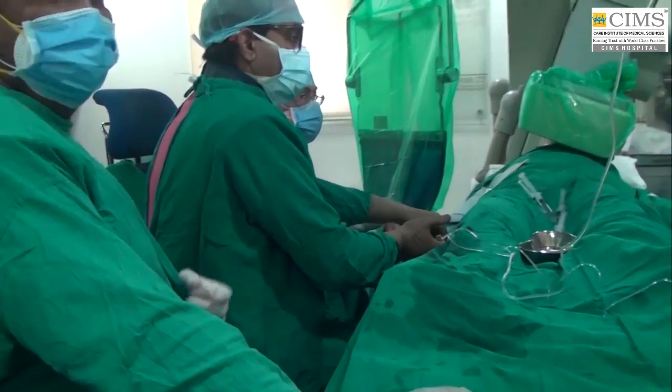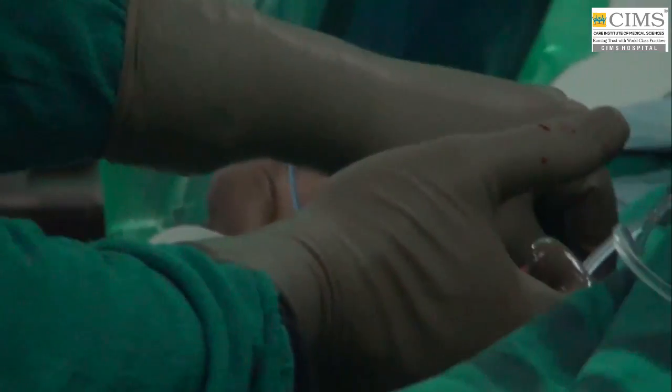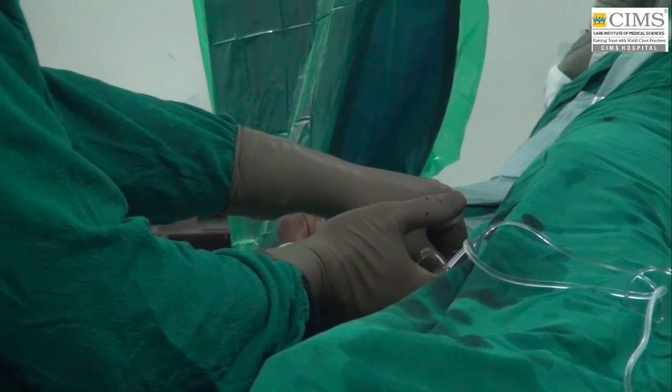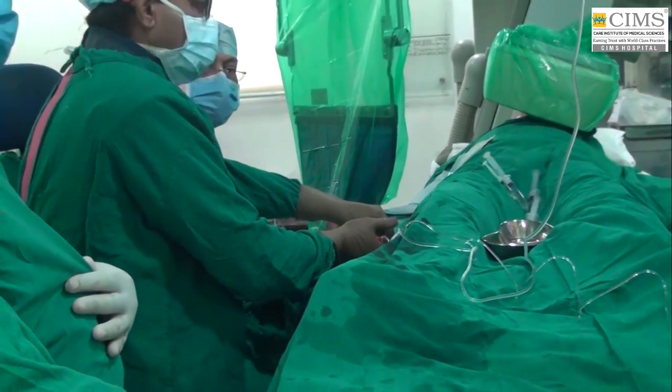As you see, I've already crossed the wire across the lesion, suggesting very likely it is a softer lesion with a recent dissected right coronary artery. Yes, the way the wire went smoothly, I think it is an acute lesion.